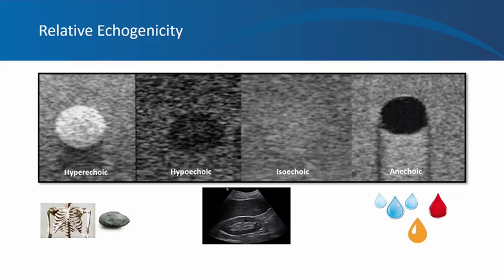When you have hydronephrosis, you see a black or anechoic area in the middle of the kidney. Simple cysts containing serous fluid will also appear black. Blood vessels containing blood appear black on ultrasound.